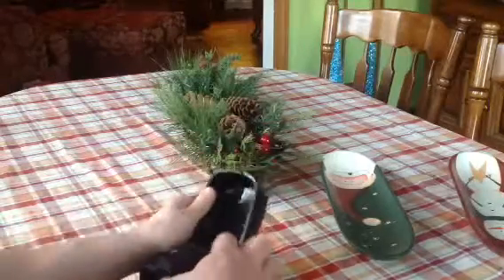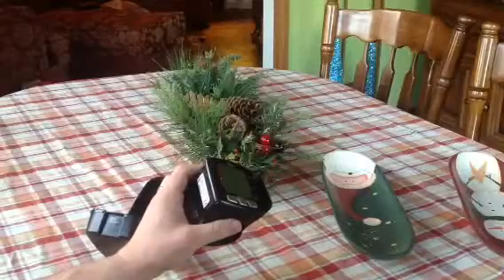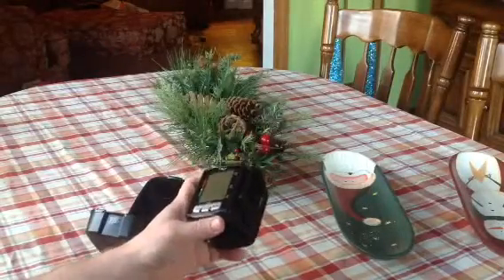This is the Azari blood pressure cuff — the blood pressure monitor — that I was asked to look at. It's pretty fantastic. I'll show you how it works.